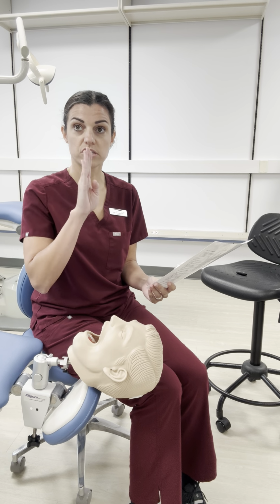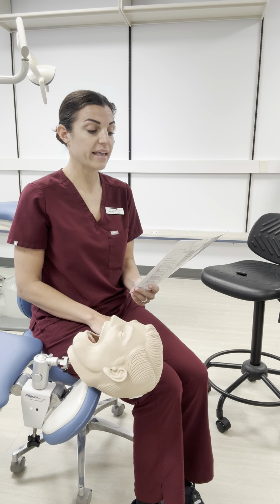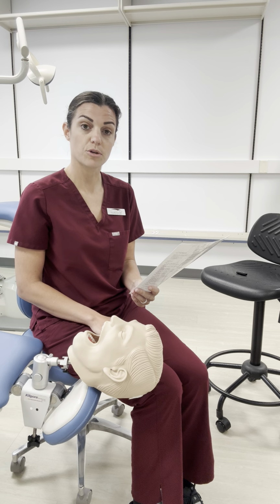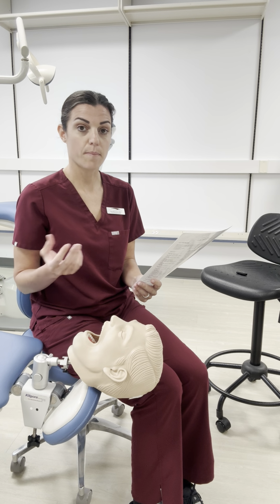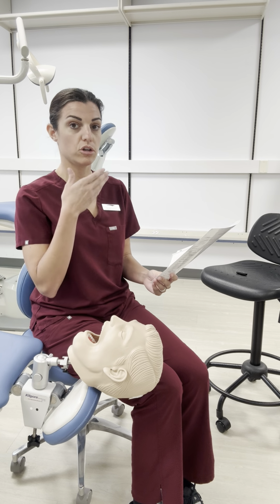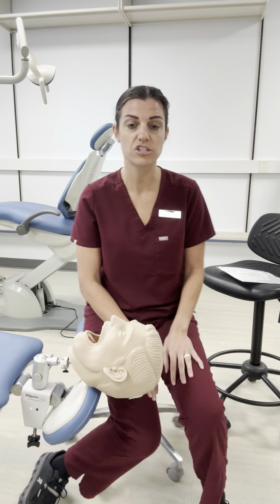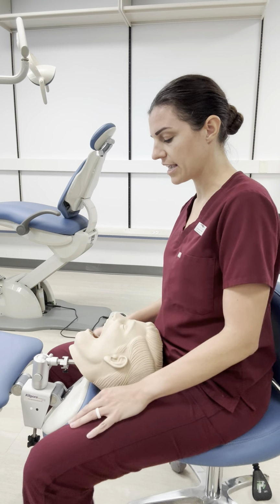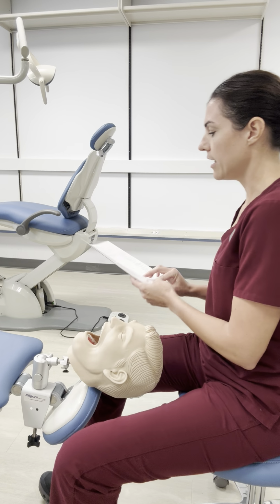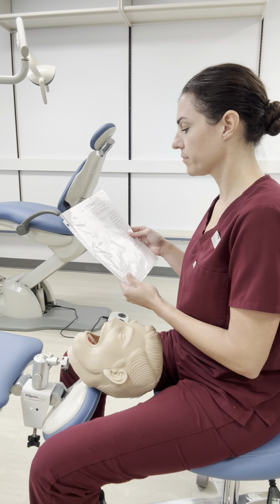All right, and then next we have maxillary anterior labial surfaces towards. So again, all the surfaces on the anterior that are closest to you, so that right-hand side. I'm again going to be in this 8 or 9 o'clock position, or you can also be in the 12 o'clock position. How the patient is going to be, remember maxillary, they're going to be chin up, and they're going to be neutral. Their head's going to be neutral. It's not going to be left or right. So I could be at the 8 or 9 position, or I could be at the 12 to get these towards surfaces, okay?